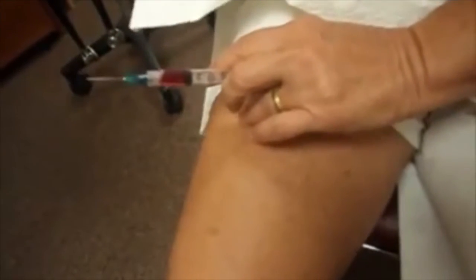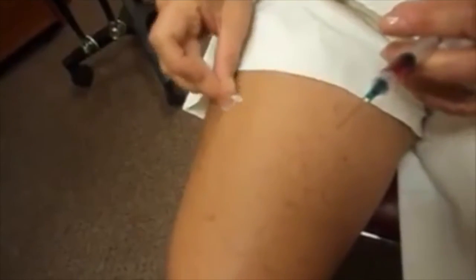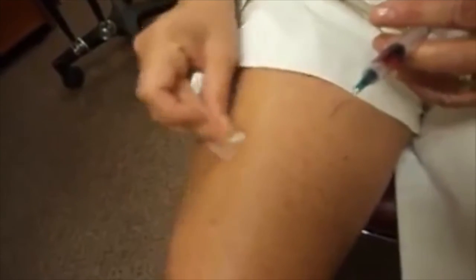We're going to demonstrate the injection technique in one step so you can see how the flow is. Again, a hand by the knee, a hand by the hip. So we have this area. We'll make a muscle, and we can see that this person, we're right over the muscle. We don't want to go midline. We want to go off to the side. The person can relax. We give it a clean, again, going from the inside out.